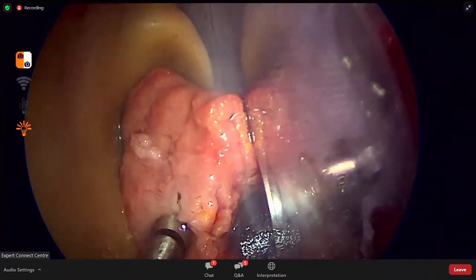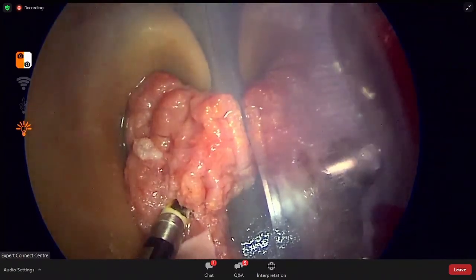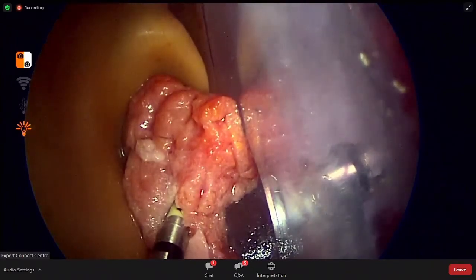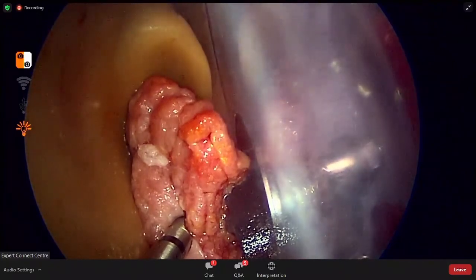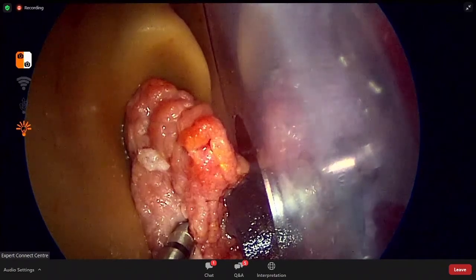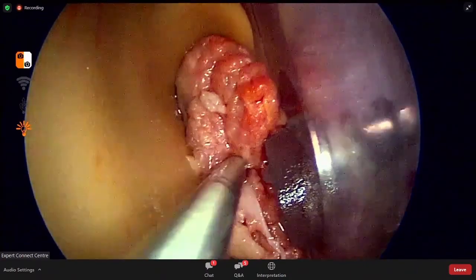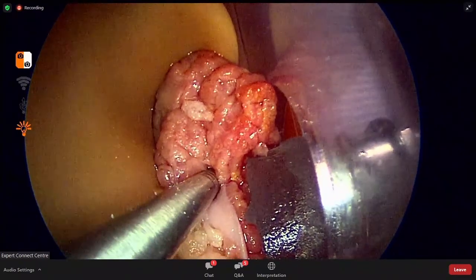Yeah, there we go. And rather than take it out completely, what I tend to do is at the incision site, I just coagulate a little bit just to ensure that the stab incision area will stop bleeding. Yeah, and then another channel. So the channel will certainly be dependent on what your endoscopic assessment is, but typically the second channel that I will make would be aiming inferiorly to the free edge of the inferior turbinate. There you go. And again, ablate.